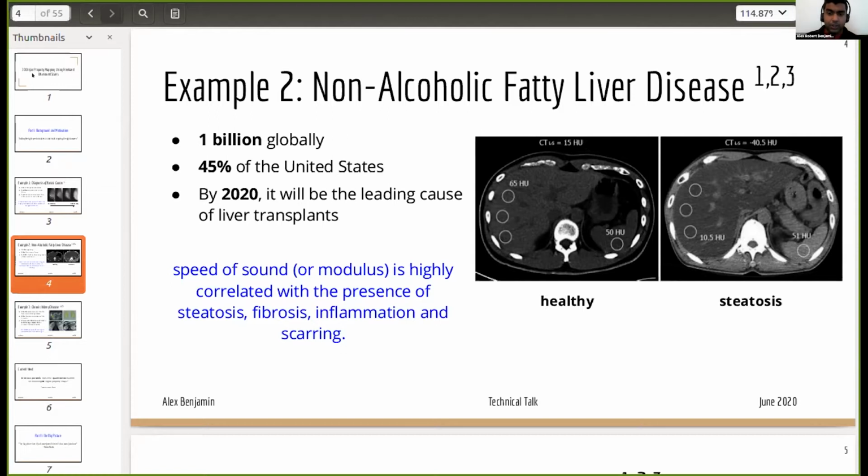diagnosing. So currently, the way it's done is CT imaging and MR imaging are the state of the art, because they can produce volumes and they can produce accurate volumes. The issue is, however, that it's not a point of care application. It takes time, it's costly. In the case of CT, you have exposure to ionizing radiation, and it doesn't lend itself really to longitudinal monitoring, because you want to do this diagnostic screening frequently and you want to do it in a cost-effective fashion.